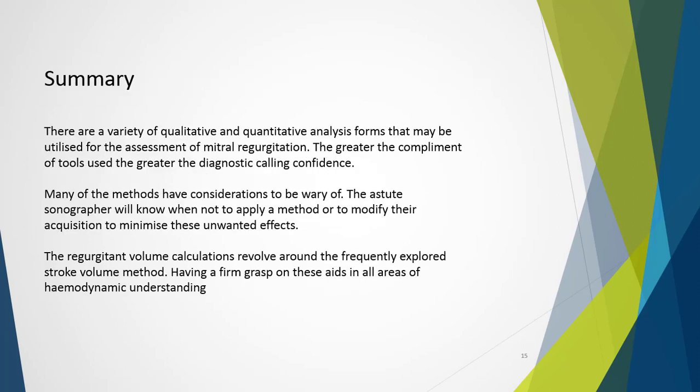So in summary, there are a variety of qualitative and quantitative analysis forms that may be utilized in our assessment of full mitral regurgitation. The greater the complement of tools used, the greater the diagnostic confidence we have in the result that we derive. Many of the methods have considerations to be wary of. The astute sonographer will know when not to apply a method or modify their acquisition to minimize these unwanted effects. And the regurgitant volume calculations revolve around the frequently explored stroke volume method. Having a firm grasp on these will aid in all areas of a hemodynamic understanding.